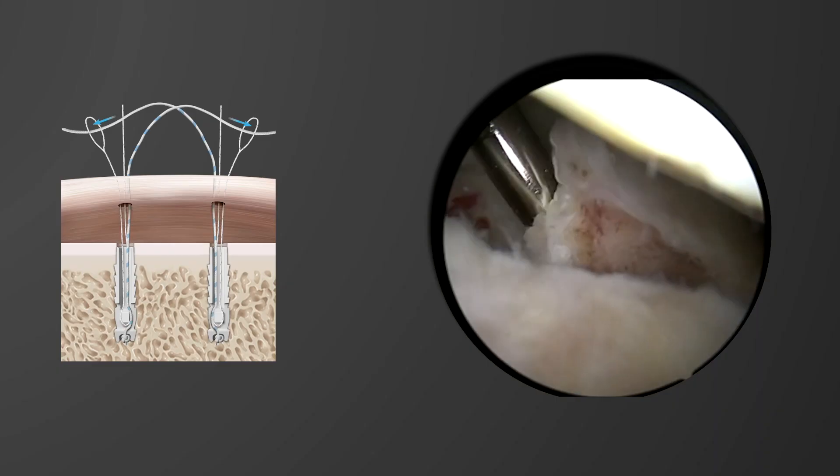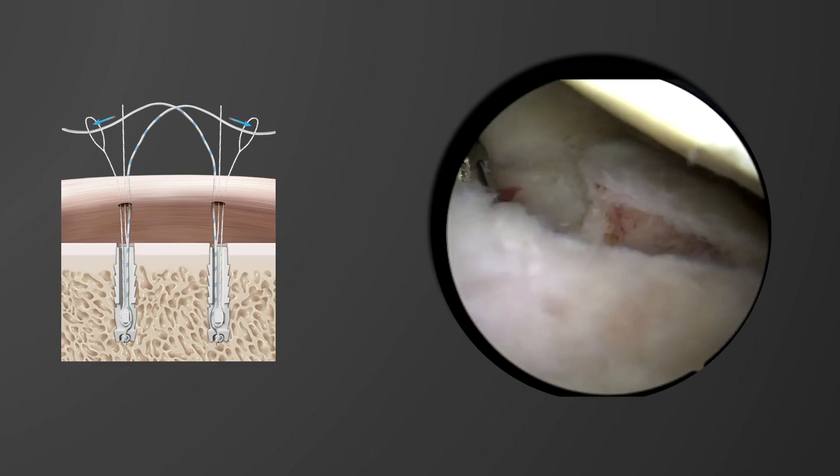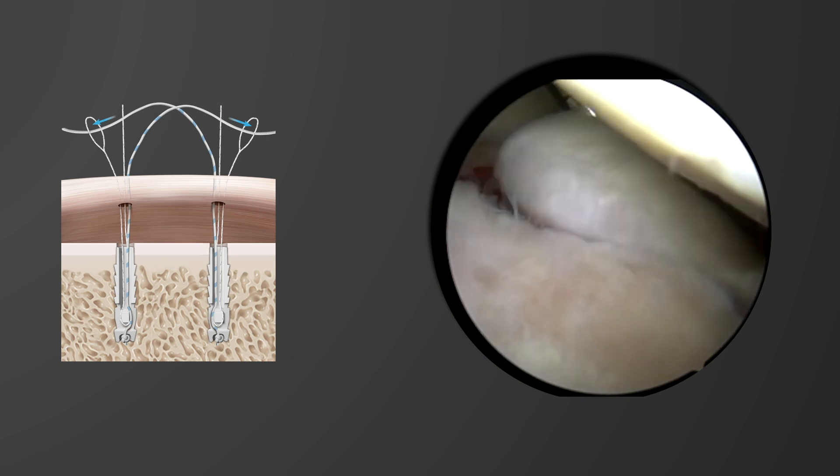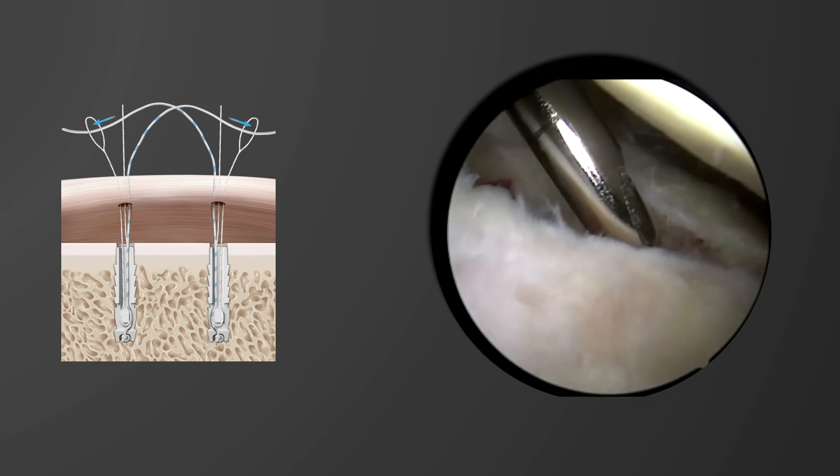On diagnostic arthroscopy, the patient's shoulder demonstrated a Bankart lesion, which is noted here. The shaver was used to free up the bony fragment, to debride the bony edges, and confirm that an anatomic reduction could be obtained.